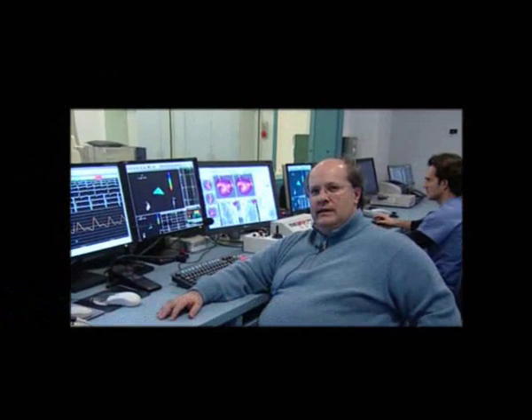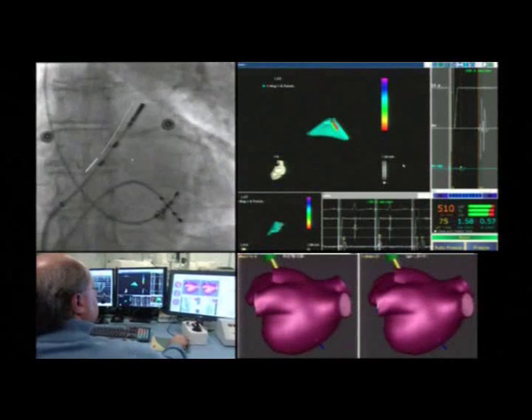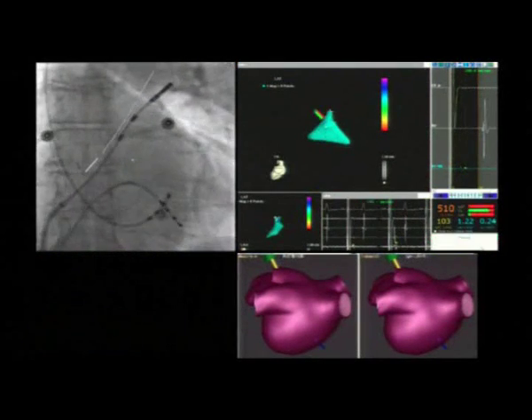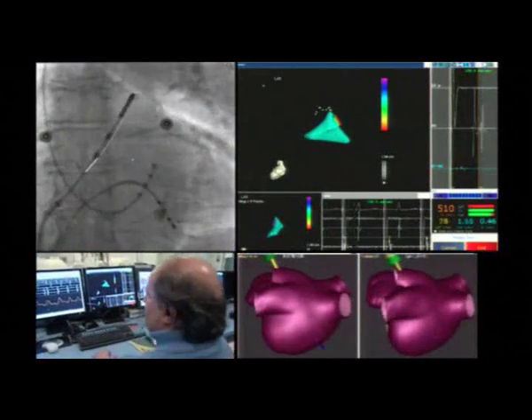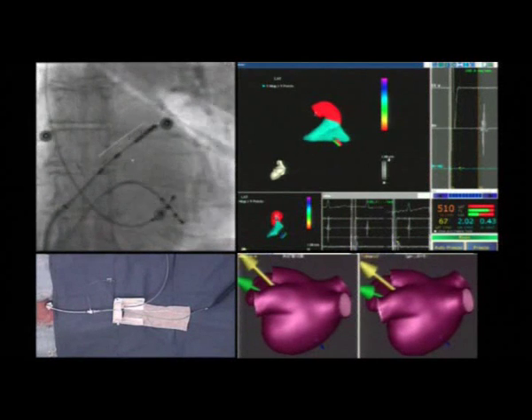We have already performed the transseptal approach to place the mapping and ablation catheter in the left atrium. This procedure will be performed using Stereotaxis technology, which is able to navigate remotely in the heart of the patient while the operator stays outside the operator room. Catheter navigation is controlled by an interface through which the operator can manipulate the main vector of the magnetic field and advance or withdraw the catheter through the cardio drive system. The operator sits outside the operating room in front of a video workstation which includes a Carto screen shown on the top right panel and two Navisphere images shown in the bottom right panel. A constant fluoroscopy image is shown in the top left panel to show the exact position of the magnetic catheter, for learning purposes only.